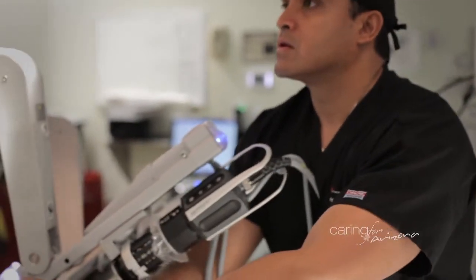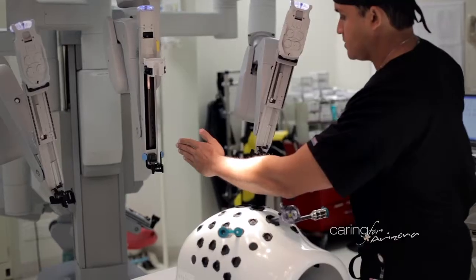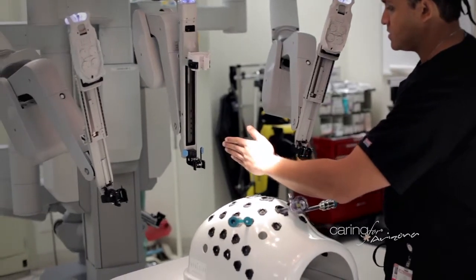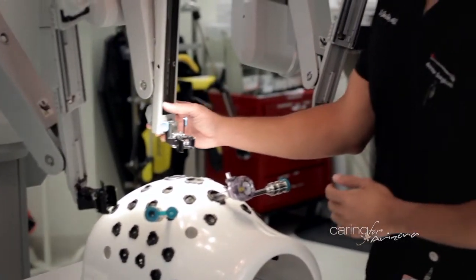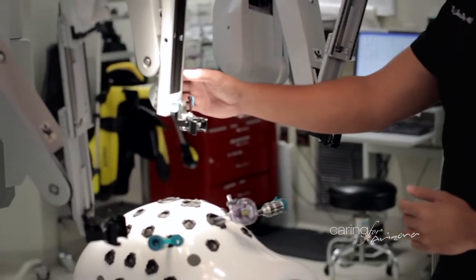Preoperatively, it's just like a normal surgery. I go and see the patient. The patient's getting IVs from the nurses and all the typical things any surgical case would do. When they're wheeled back to the operating room, the difference starts after the patient is asleep and already on the table. I guide the robot in over the patient in the position that I need the working arms of the robot to be to have a successful surgery.